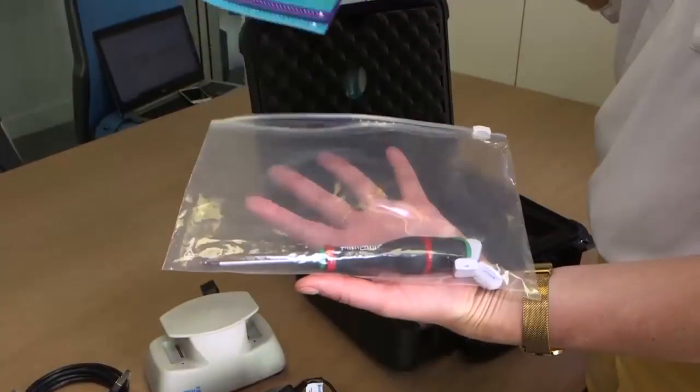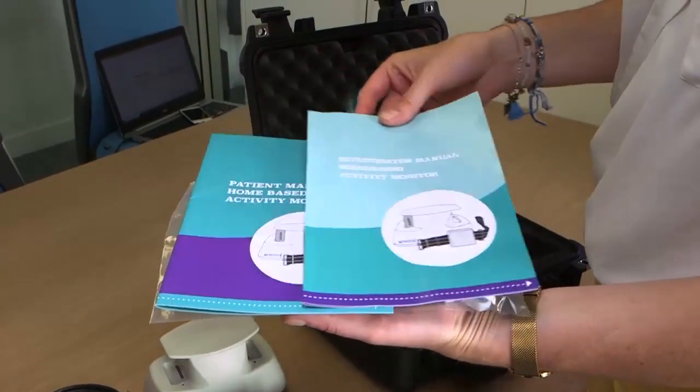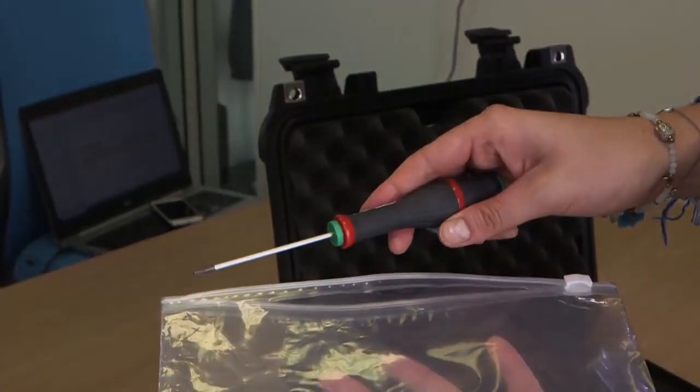A second participant manual and an investigator manual, a screwdriver to enable replacement of the USB key, and blanking.